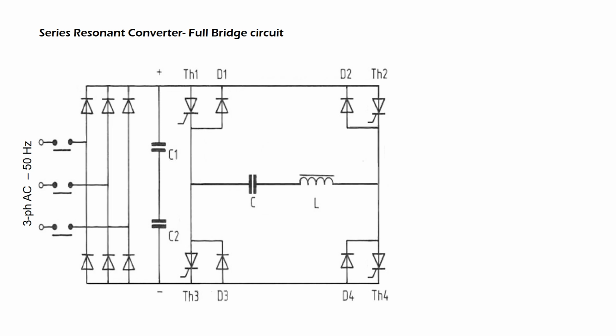The recovery time is the time required by the thyristor to change from the conductive to the blocked condition, plus a certain safety margin. When the thyristors TH2 and TH3 fire, the current stops choosing the path through D1 and D4. The current now flows from plus to minus via TH2, inductor L, capacitor C and thyristor TH3.